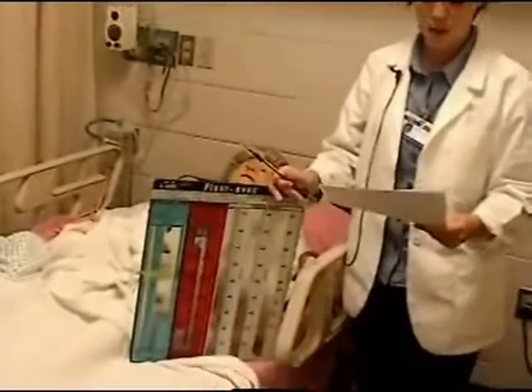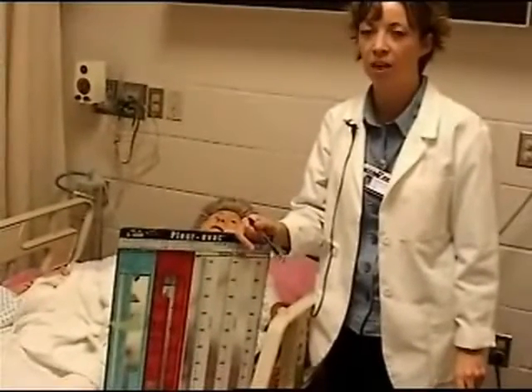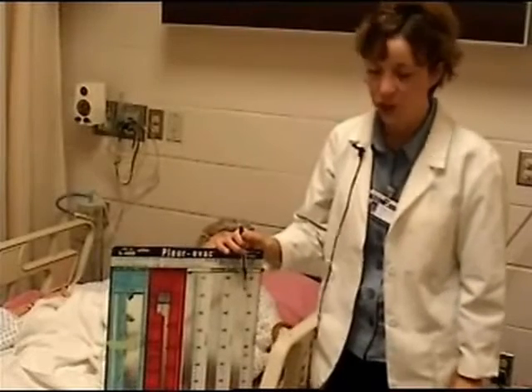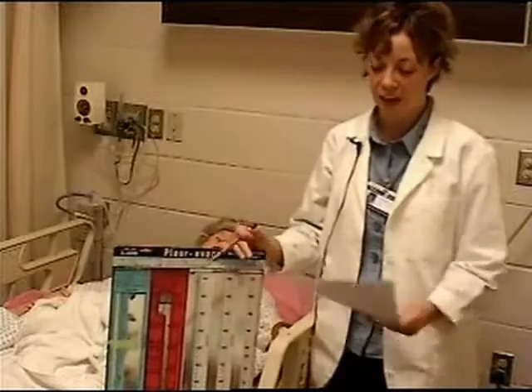With the patient, some hospital policies will say after the first 24 hours of the patient having a chest tube, then the I and O of the drainage can be every 8 hours. You need to follow what your policy states on that.